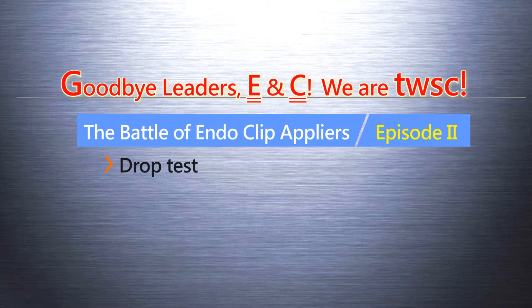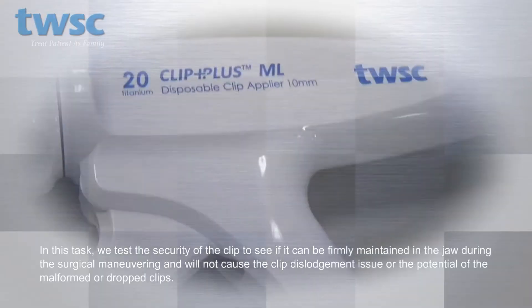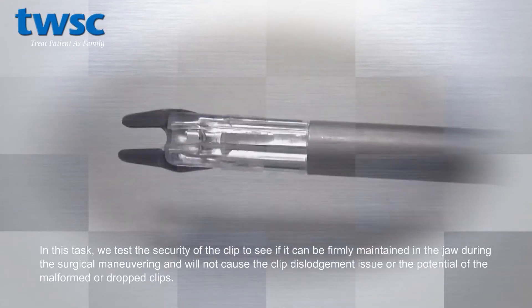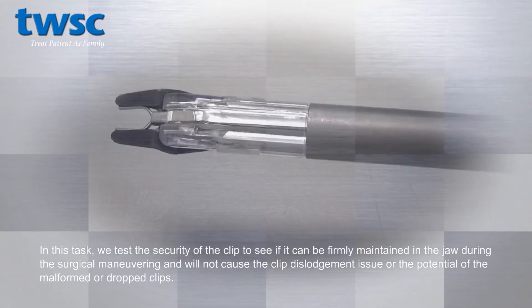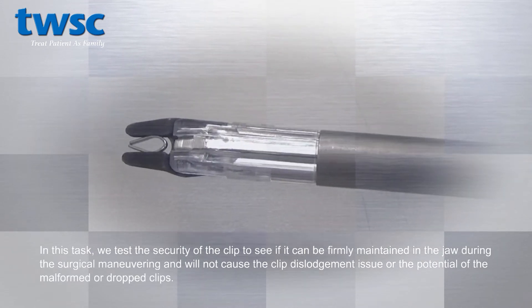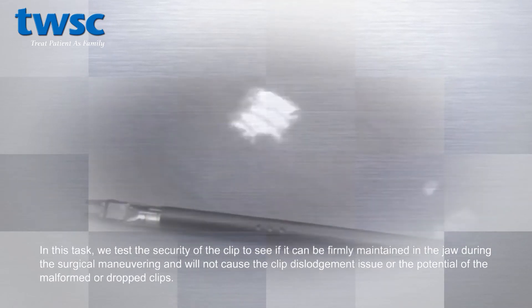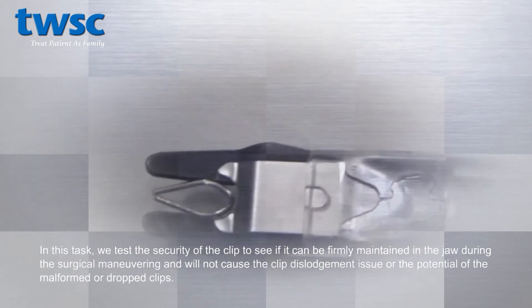The battle of Endo Clip Appliers, episode 2: drop test. In this task, we test the security of the clip to see if it can be firmly maintained in the jaw during surgical maneuvering, and will not cause clip dislodgement or the potential of malformed or dropped clips.